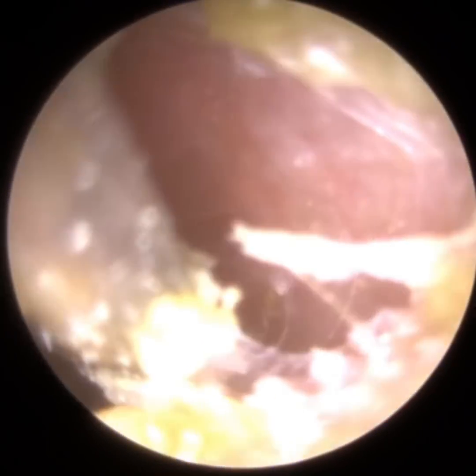What I'm going to do now is mop up as much of the soft, dead, wet skin that's coating the canal as possible. You can just tell by the colour of this ear canal, it's a bit more red, a bit more angry, especially at the entrance.